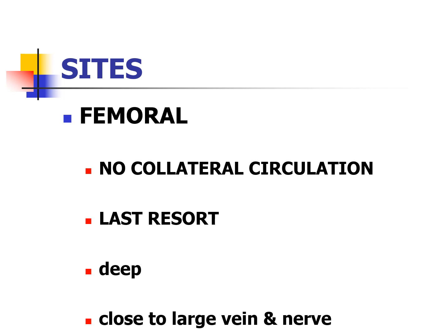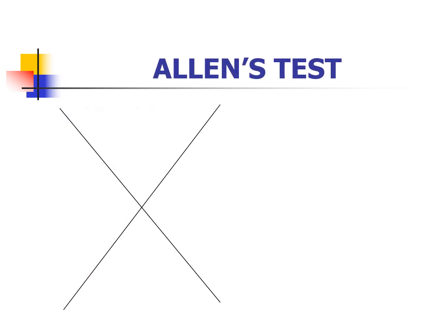During a code, we like to see where their blood gas is and rule out what's called H's and T's. You guys can look that up on your own. So we're trying to rule out H's and T's in ACLS, if you want to Google that. And then we're looking at other things like ionized calcium. We're going to run those labs for electrolytes. We're going to run them for a lot of stuff. So a lot of stuff is going to be run on that blood gas, and so that's going to be the best site to use.